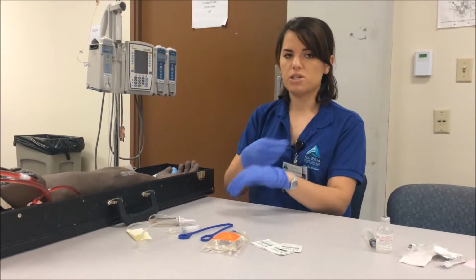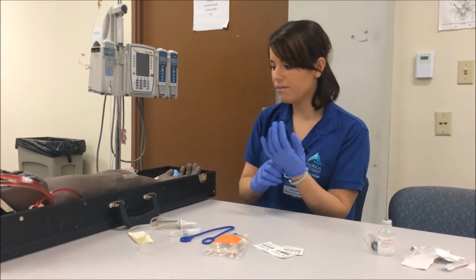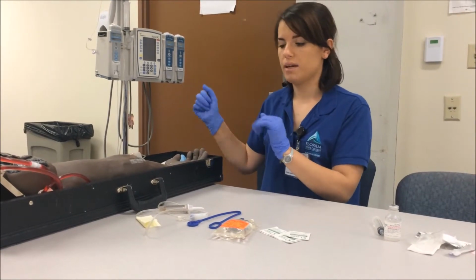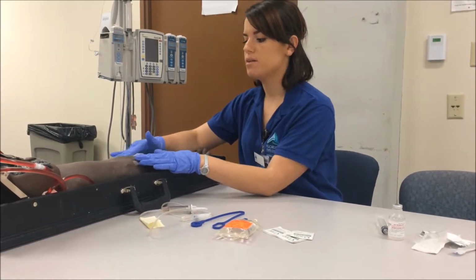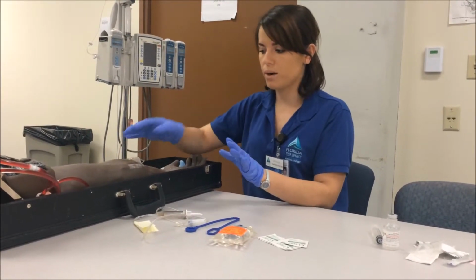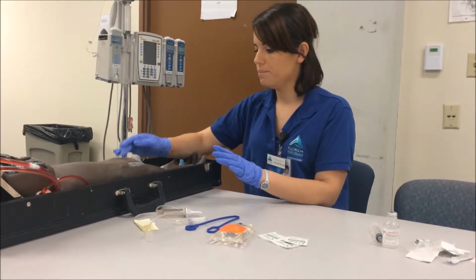I'll also make sure to ask my patient for any known allergies that they might have or might know of. And then, before I hang my medication, I'm going to look at my patient's insertion site to make sure there's no phlebitis or infiltration, redness, or swelling present, and their site looks good.